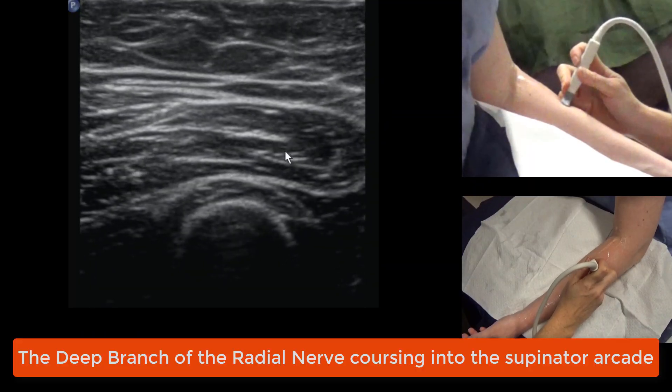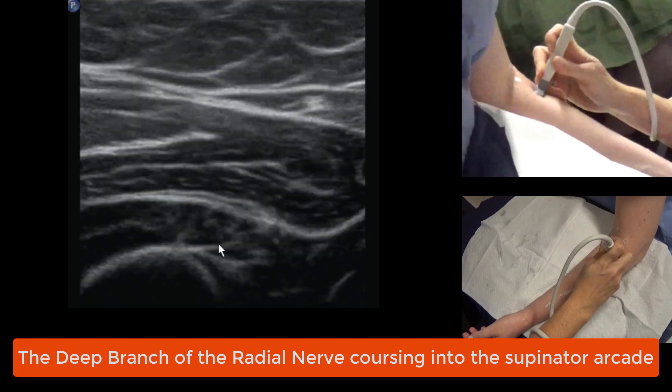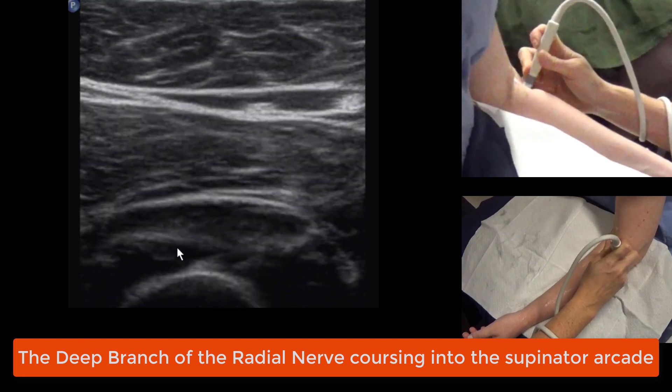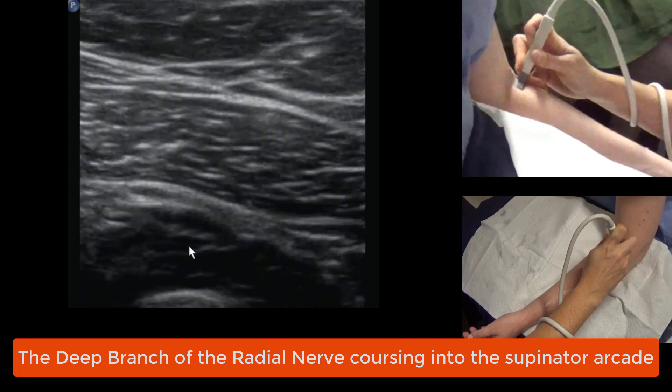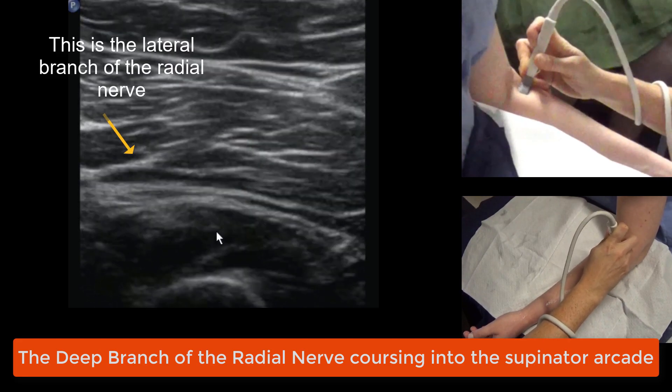You're sitting over brachioradialis. This is brachioradialis. What's underneath it is supinator. We're running our eye through the muscle and looking for a little black dot that starts outside the muscle and runs into the muscle.